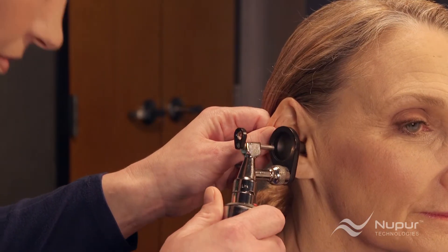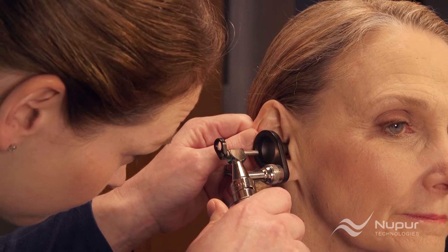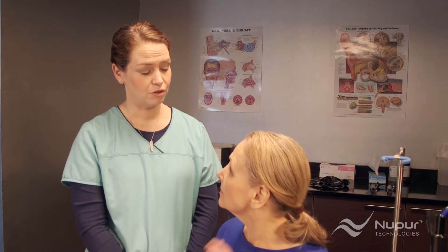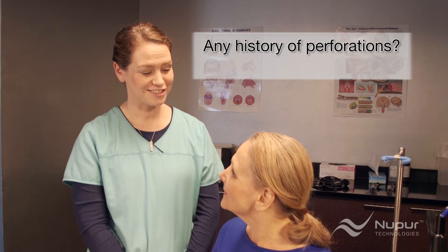Step 1 is doing an otoscopic examination of the ear canal and eardrum. If you find earwax in the examination that needs to be removed, you should then ask some basic questions to confirm the irrigator is the right instrument. One: do you have a history of tympanic or eardrum perforations, or have you had a perforation in the last year? Two: are you experiencing pain in either of your ears? If the answer to either of these questions is yes, the patient should consult an ear specialist before using the irrigator.